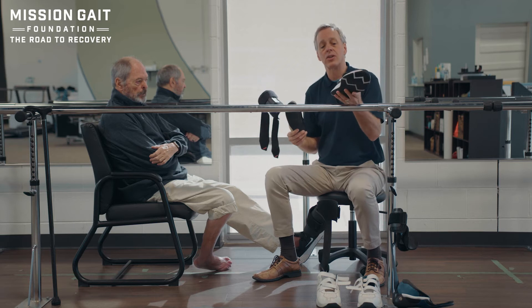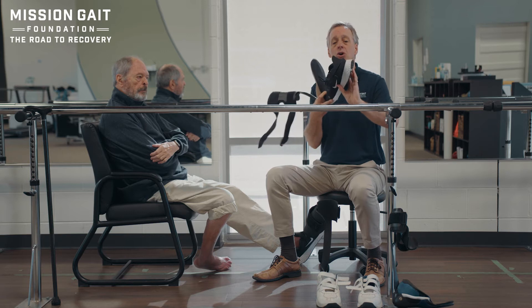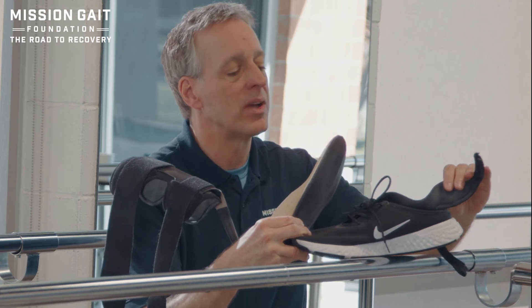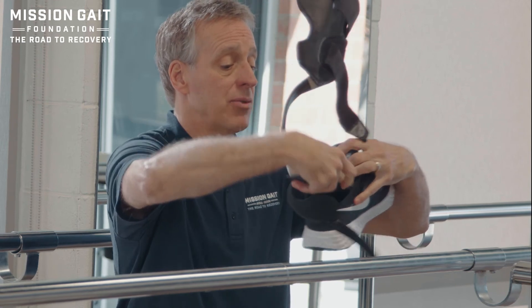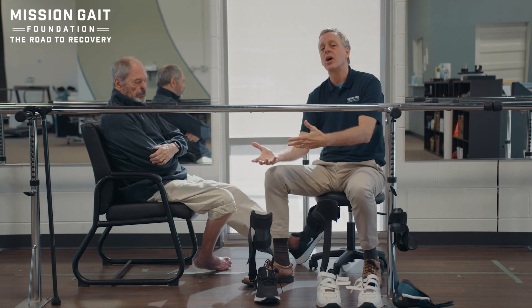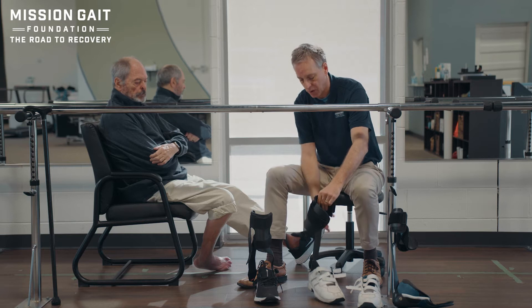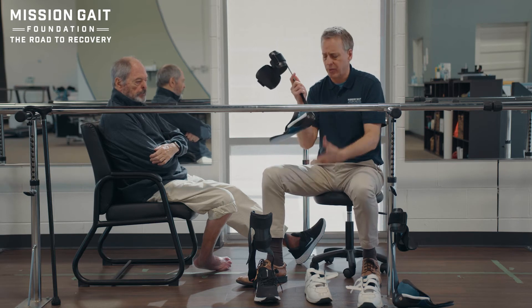In his particular shoe, we have a really interesting shoe that zips open in the back - a great setup for getting in and out of the brace with less effort, avoiding wrestling the shoe into place. We'll look at that in a second, but I also want to talk about the second option. Here's a gentleman going from one brace and trialing another one to see if a different system works. This is a different style of brace - still carbon fiber, but these are actually very, very different.